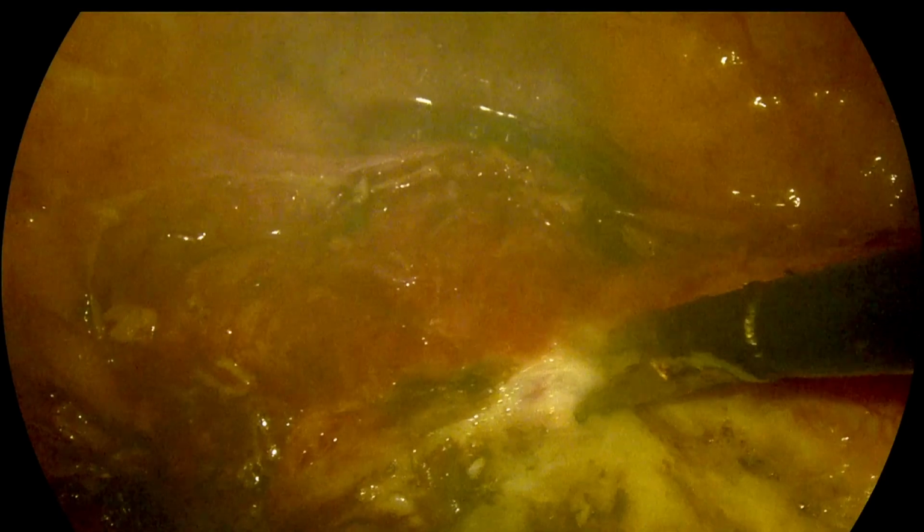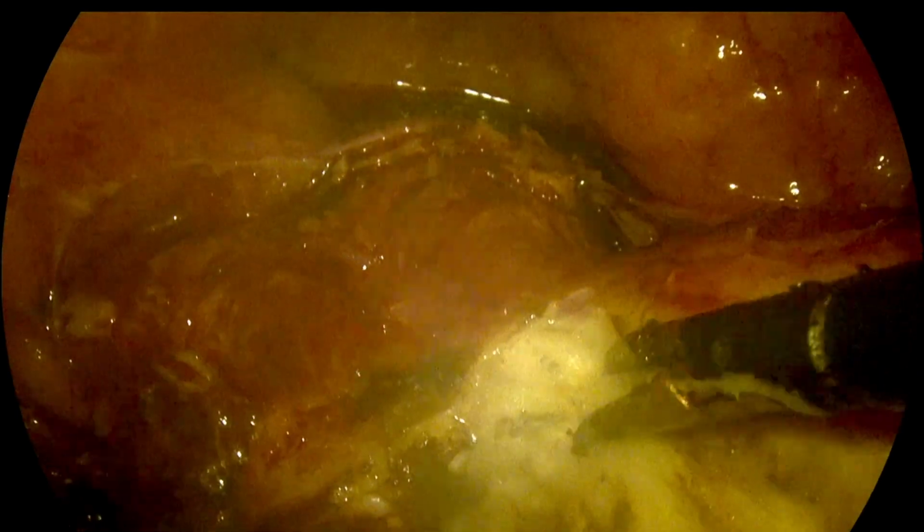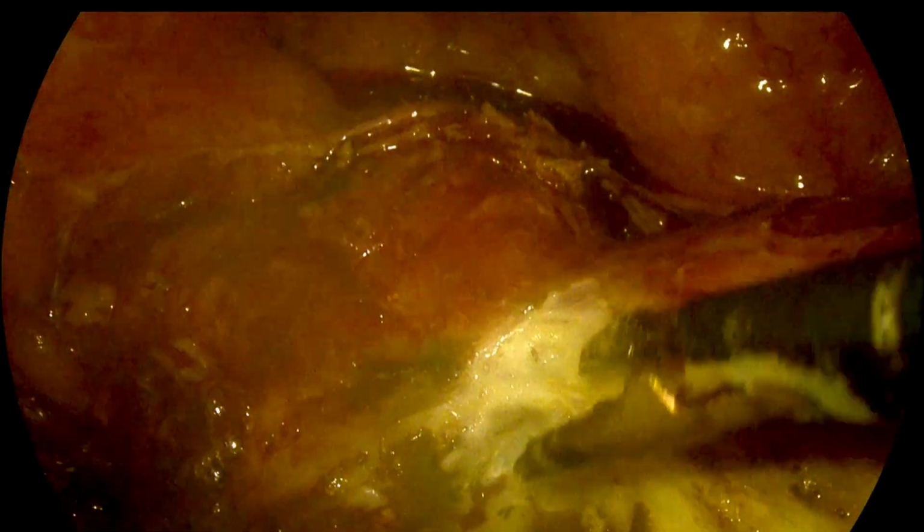Now we are going near the cervix, and still some amount of uterovesical fold of peritoneum between the bladder and the cervix needs to be separated. So we continue to dissect the uterine vessels and continue the dissection medial to the uterine vessels. That prevents injury to the ureter.